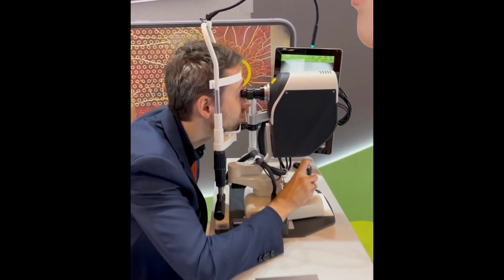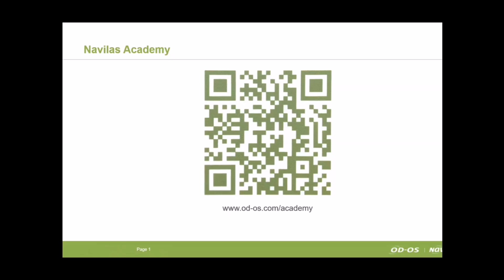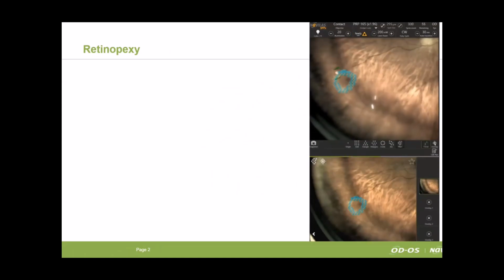I hope this clarifies my qualification regarding Navilas application. So let's begin. First of all, if you are a current Navilas user, consider registering in Navilas Academy as it has all the necessary training videos you might require. In this video, we will not cover the lens treatments with Navilas because they are quite similar to what is done on a slit lamp.